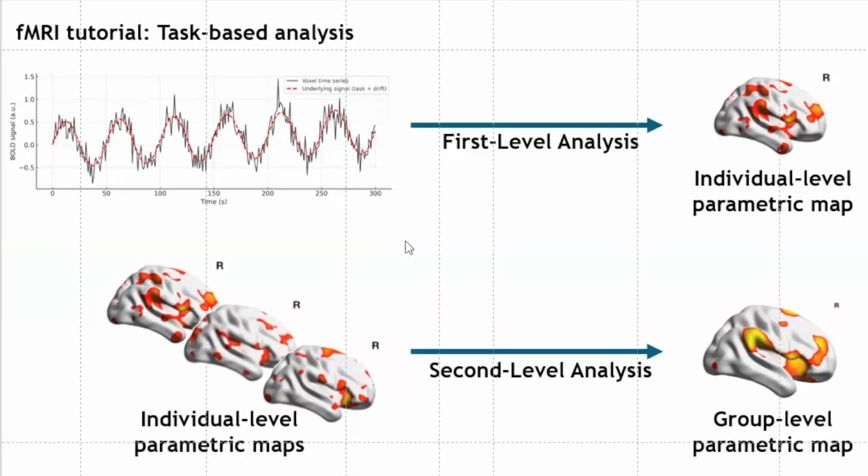The number of trials for congruent versus incongruent is different. It's unbalanced. It's not good to have this kind of condition because the correlation can be higher in one condition, and the sampling of your time series will be different. So it's not ideal, but it's better to have balance. In any kind of statistics, it's better when you are comparing the same. It's like comparing 200 subjects versus 10. It's not really a good way to do it.